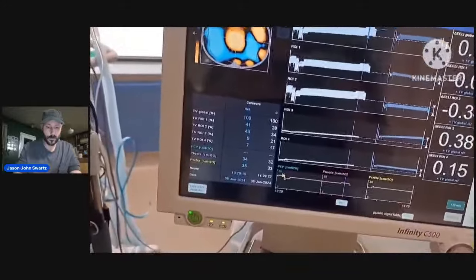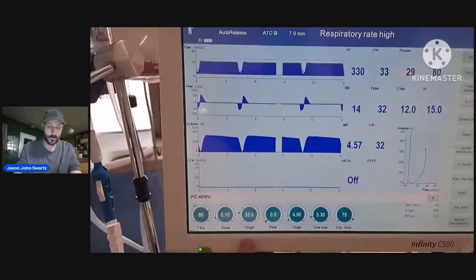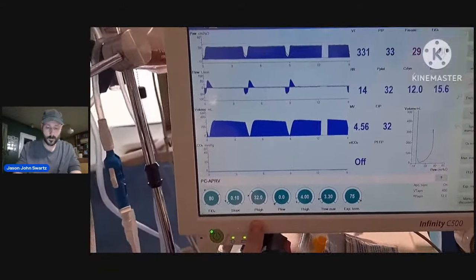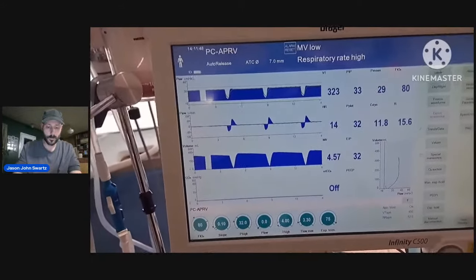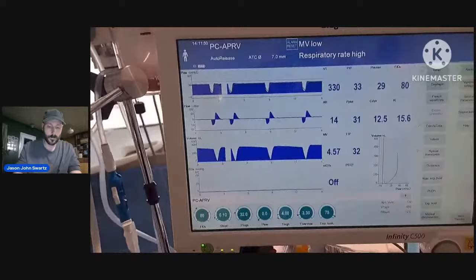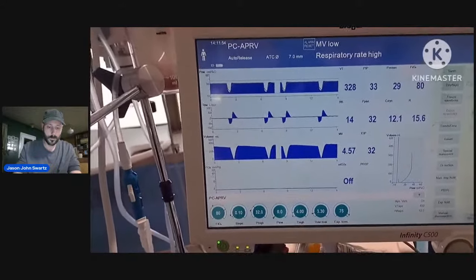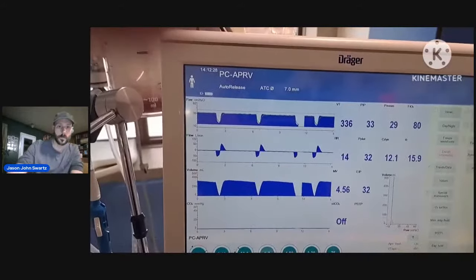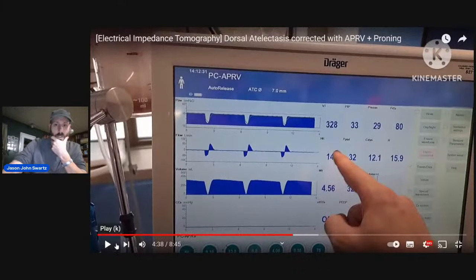Patient right now is still in transition. I went from peak inspiratory pressure of 32 to P high of 32. And at the end of my shift, or tomorrow, I'm going to try to put 32, 30, 28, 26, to see if the patient still requires the 30. And the blood gases were good here with a rate of. All right.